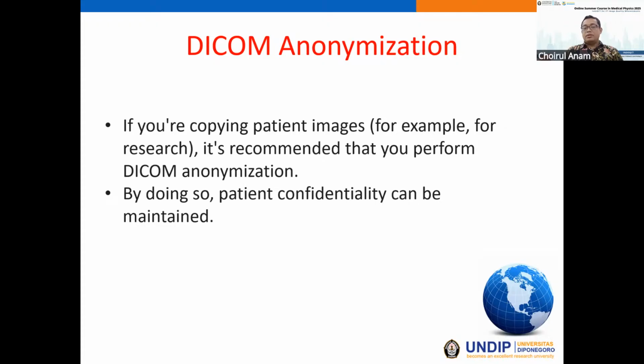By doing so, patient confidentiality can be maintained. So ethically we can still use the image without revealing information about the patient. So the DICOM anonymization is very important.